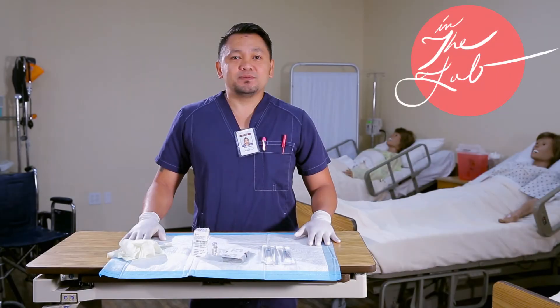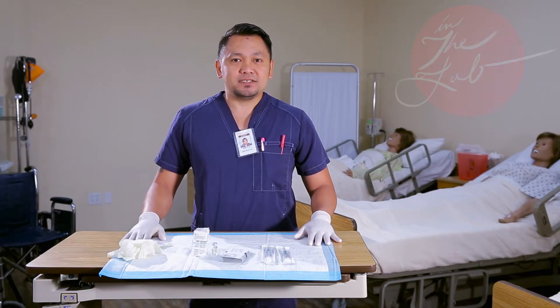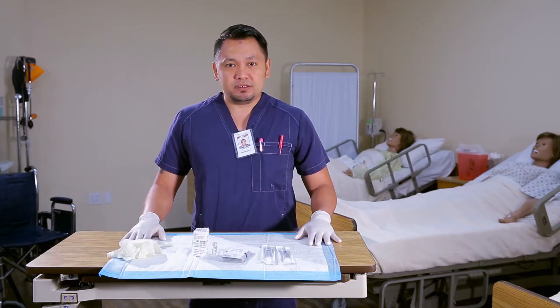Good morning. My name is Mr. Noel and welcome to Angelus Institute Simulation Lab. Today we will be demonstrating the proper procedure of intradermal injection.